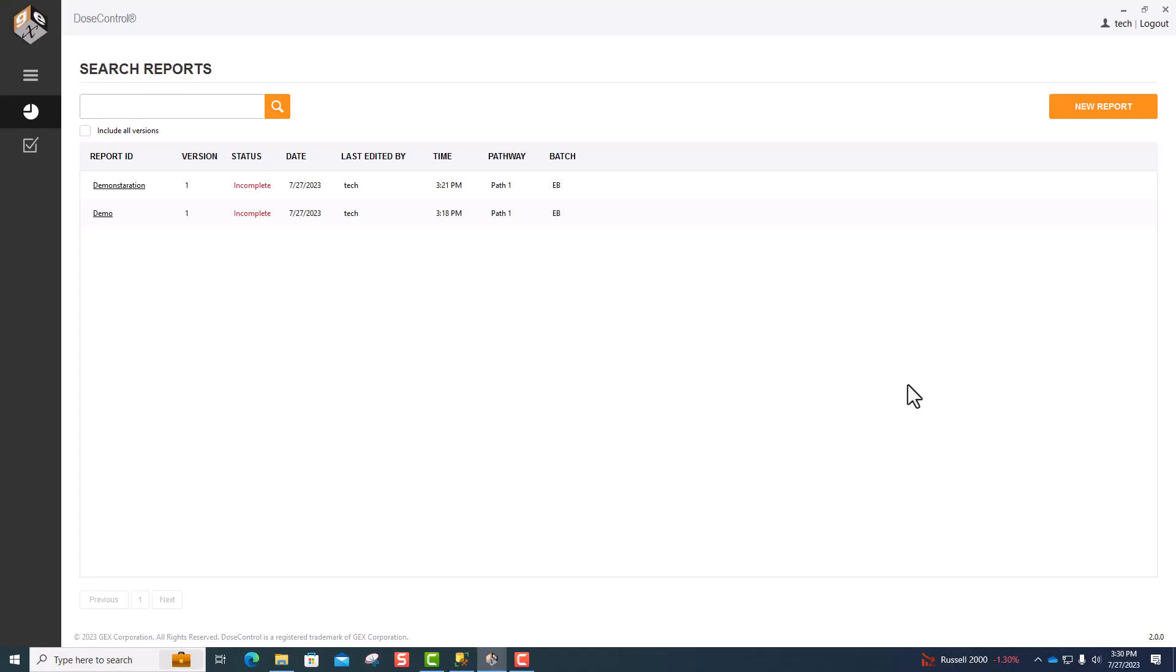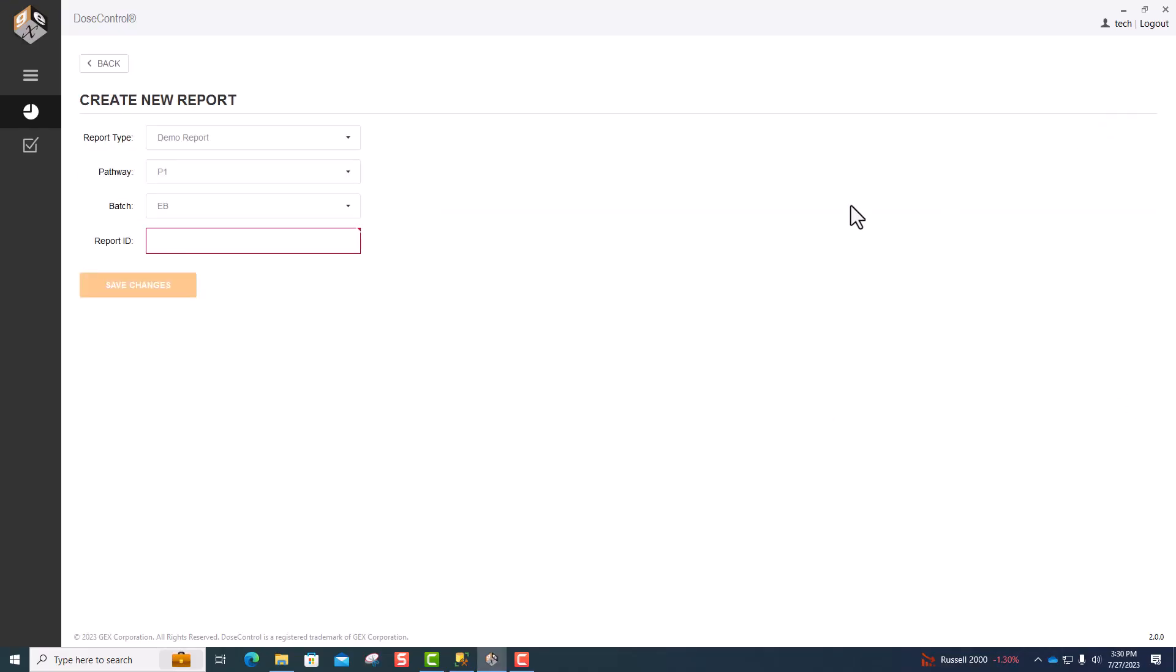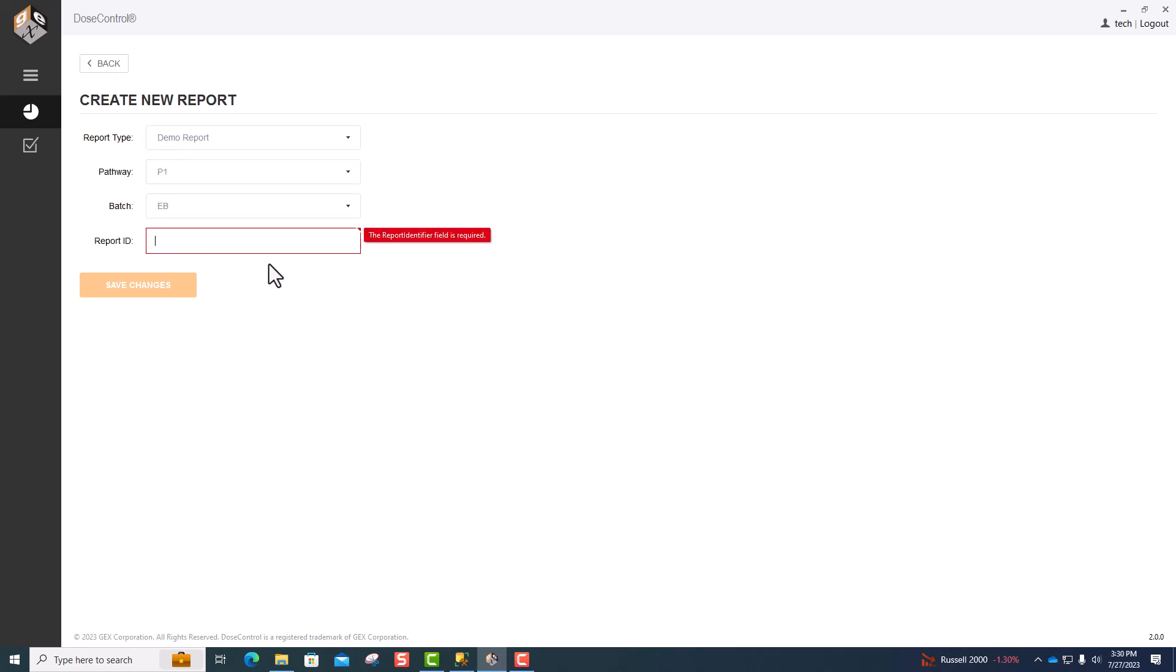The first thing we're going to do is create a new report in Dose Control. In this window, you have options to select your report type, the pathway, and the dosimeter batch. All you have to do is input a report ID and hit Save Changes.